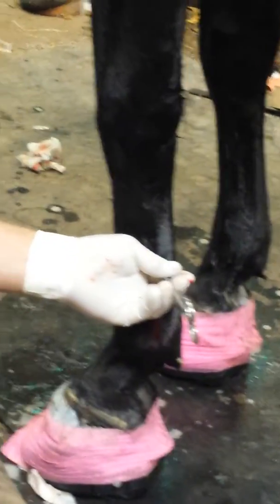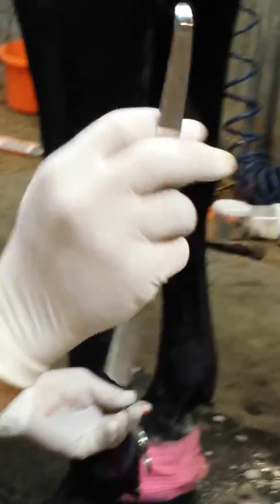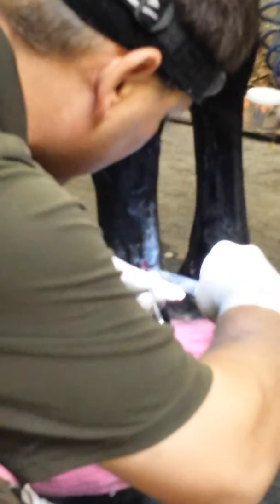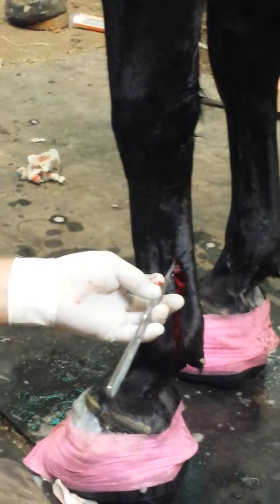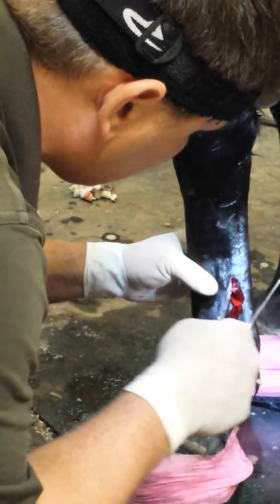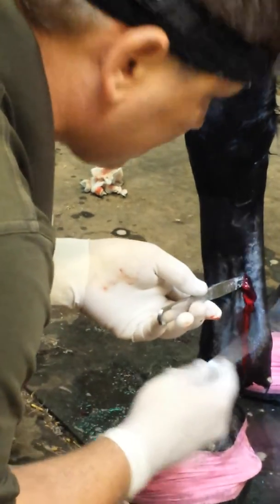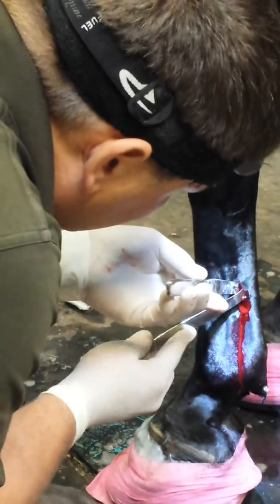Before I pull that out — it's retracted, it's got a hook on it. This one has a little bit more curve. Before I pull that out, I'll send my retractor right in. First retractor goes in between the deep and suspensory. The second retractor, it's got a little bit less bend, goes between deep and superficial.